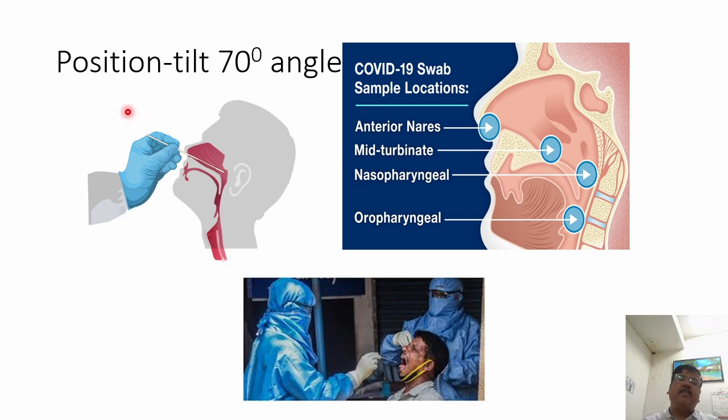While collecting the sample, ask the patient to tilt the head backward at a 70-degree angle and we can collect the samples. Anterior nares rarely, but mid-turbinate. For the rapid antigen kit, the samples should be collected from the mid-turbinate. And then for the RT-PCR test for COVID-19, nasopharyngeal and oropharyngeal swabs are added in the same VTM. Both the swabs are put in the same VTM and immediately transported. If there is a delay in transport, I repeat, we should keep it at a cold temperature, 4 degrees Celsius.